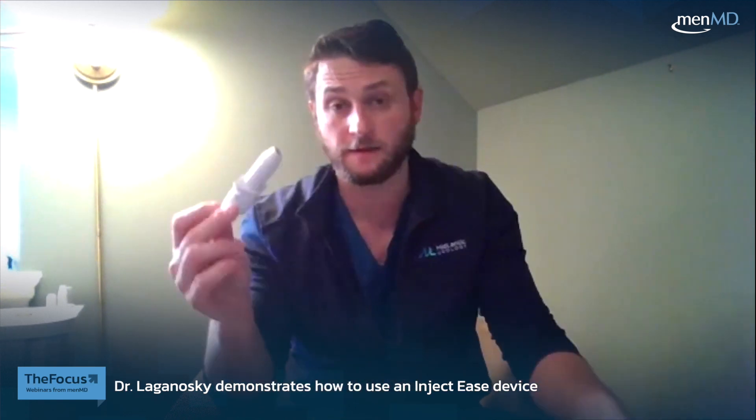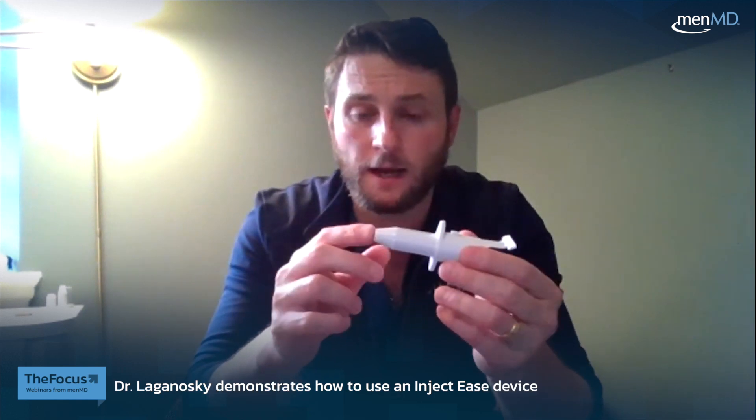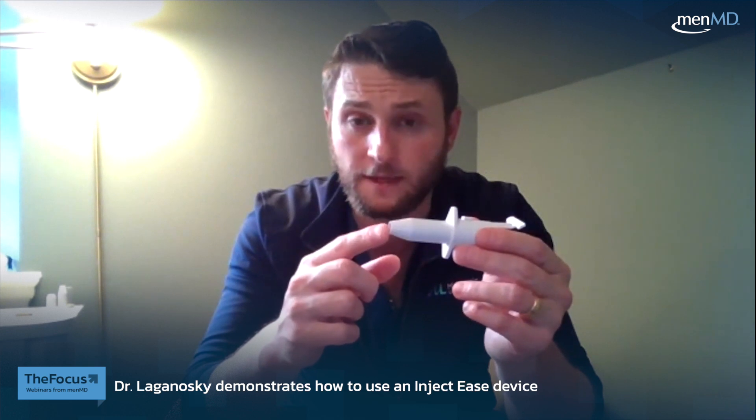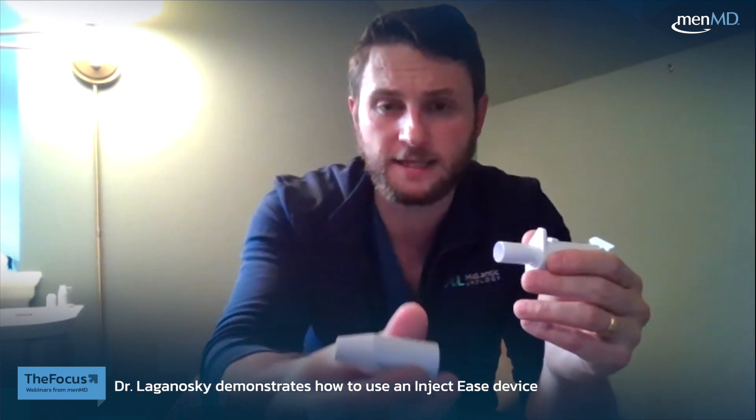I've assembled an option for you, but there are a couple of ways we can modify this device. It's meant to regulate the amount of needle tip that comes out and to make this a straightforward, reproducible way to do these injections over time.